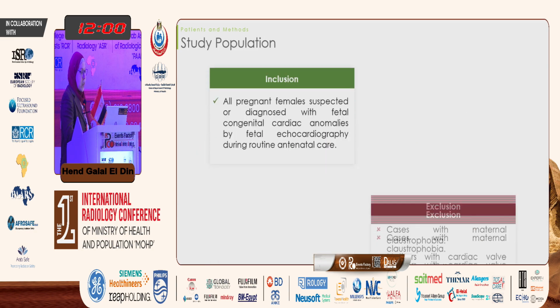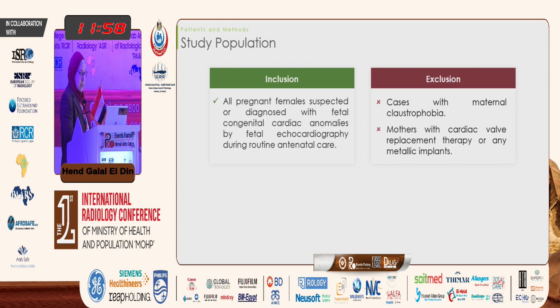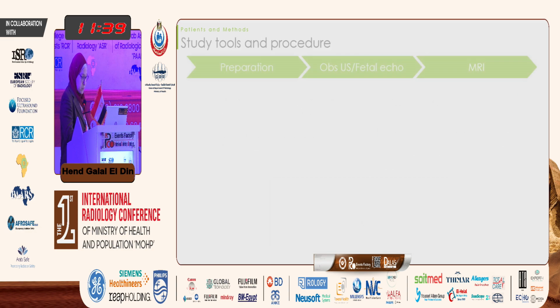We included all pregnant females suspected or diagnosed with fetal congenital cardiac abnormality by fetal echo during routine antenatal care, and excluded any case with maternal claustrophobia, and any mother with cardiac valve replacement therapy or metallic implants. Our study included 52 pregnant females.